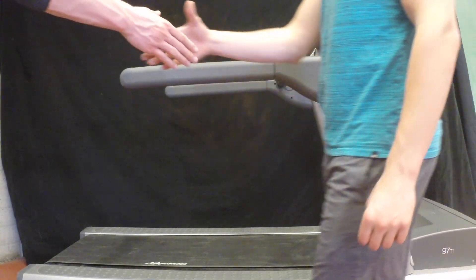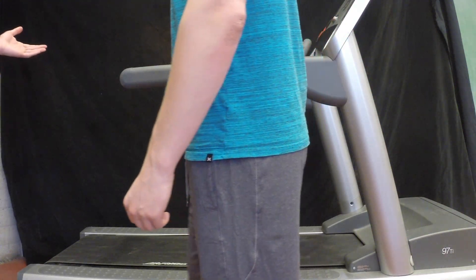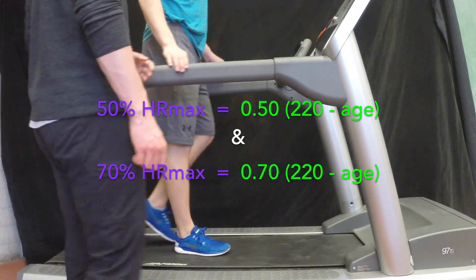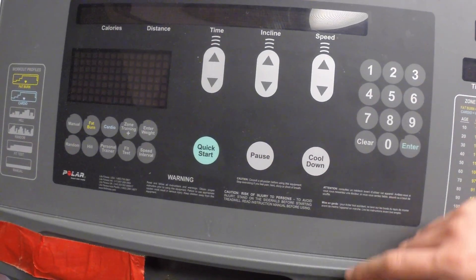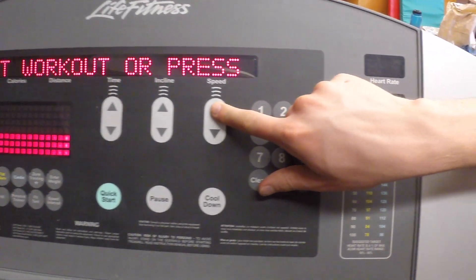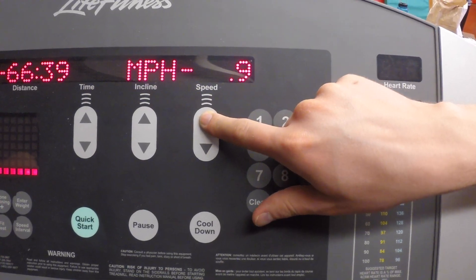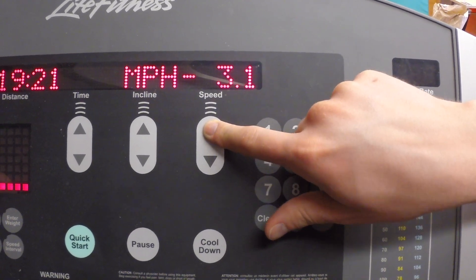To do the Ebling treadmill test, first calculate 50% and 70% of the client's maximum heart rate. Now start with a warm-up at 0% grade for 4 minutes. Use a speed that you think will get them between that 50% and 70% heart rate max. This is usually anywhere between 3.2 and 4 miles per hour.